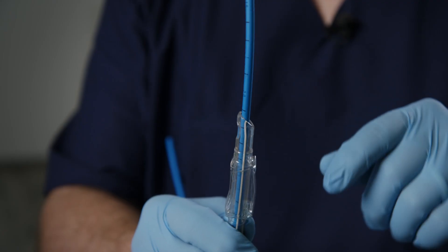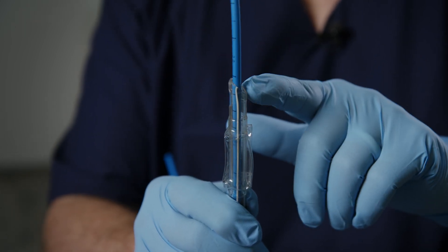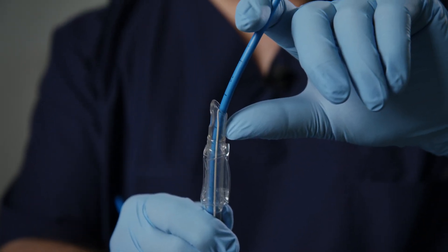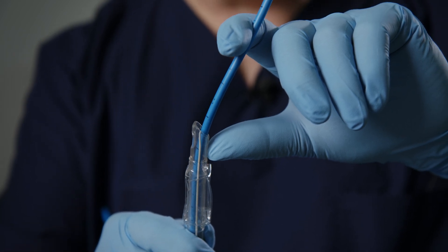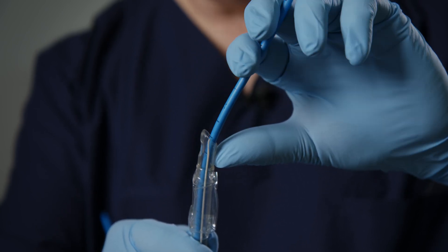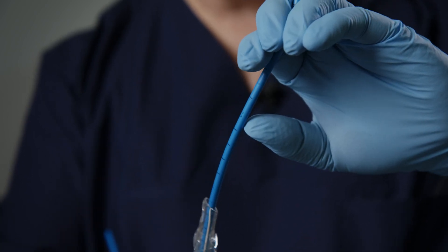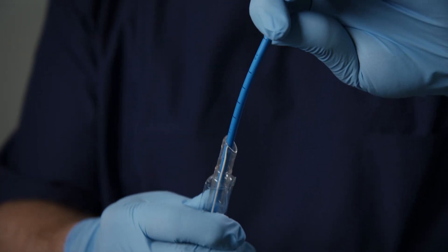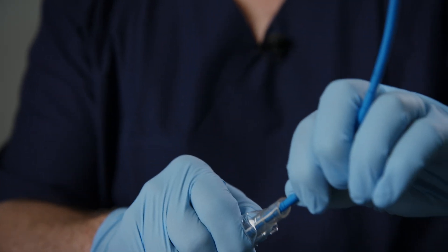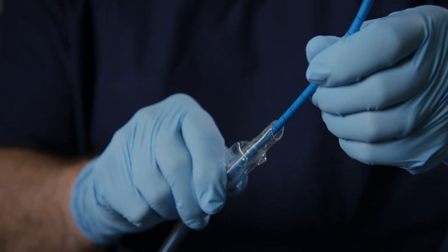We'll show that to you in close-up now. Because we're using left cut bevel tracheal tubes in the modern day and age, as the tracheal tube is advanced along the bougie, a small gap can occur during the passage of the tracheal tube. This gap is known to trap the right corniculate cartilage and essentially stop the advancement of the tracheal tube. The maneuver to perform should you trap the tracheal tube on the cartilaginous structure is to disengage and perform a counterclockwise leftward turn of the tracheal tube to minimize the gap and re-advance into the larynx. We are essentially putting the murphy eye from the 3 o'clock position to the 12 o'clock position in order to minimize the gap.